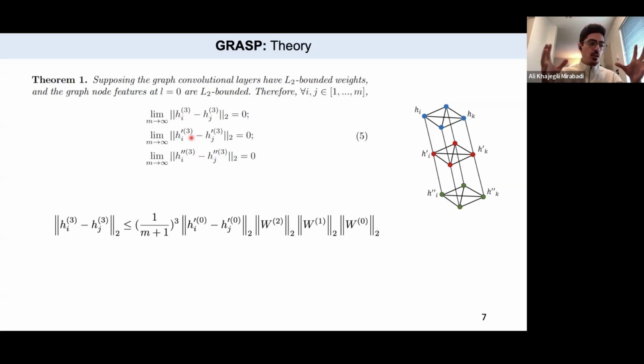And I also gave all the encodings from all 3 magnifications to ABMIL. It was interesting because the performance sometimes drops when you give all the patches from 3 different magnifications together to an ABMIL model, because that model doesn't understand magnification.